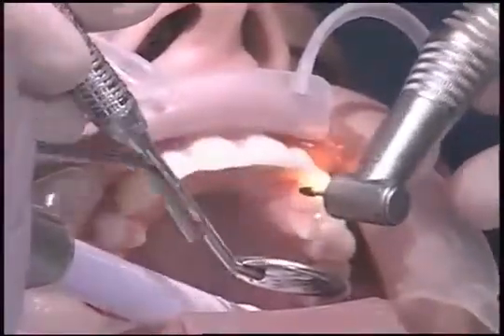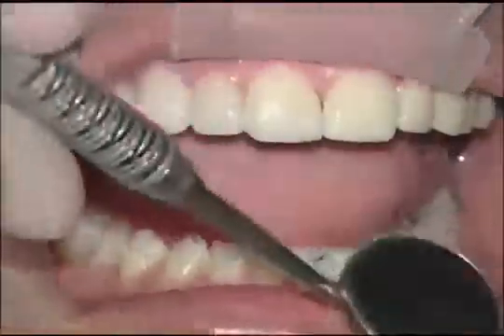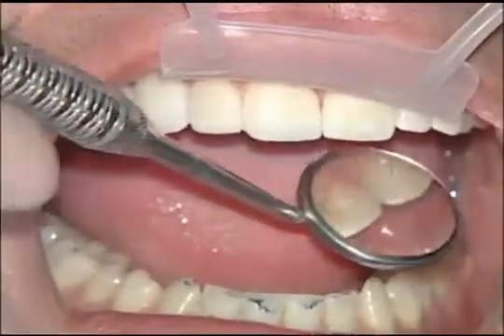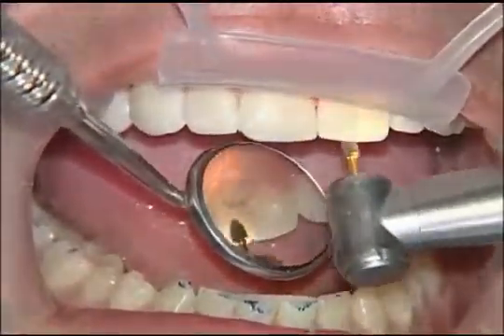When we finish smoothing everything off on the lingual, the next step is to use our articulating paper to go in and see if we have any prematurities. And actually, what happens more commonly is we have some excess cement that's left over. When you use a translucent resin cement, oftentimes you'll have excess resin cement that you didn't see on a tooth, and that ends up being your high spot.